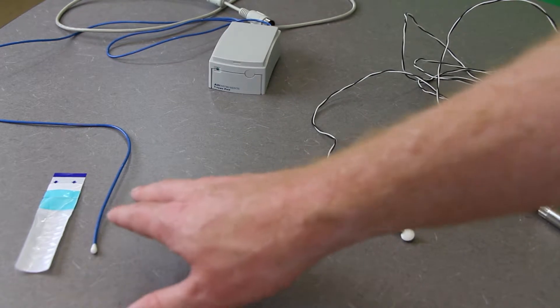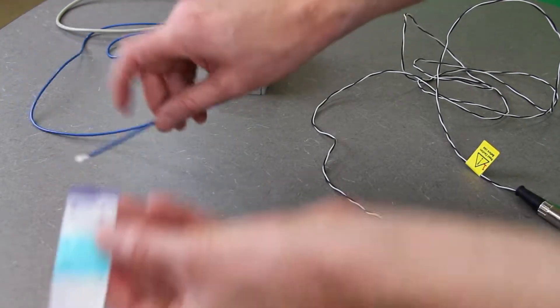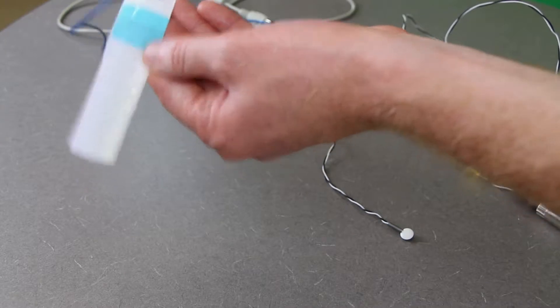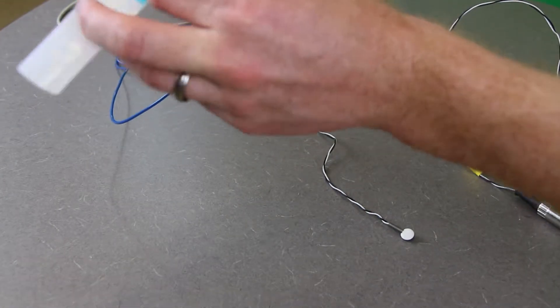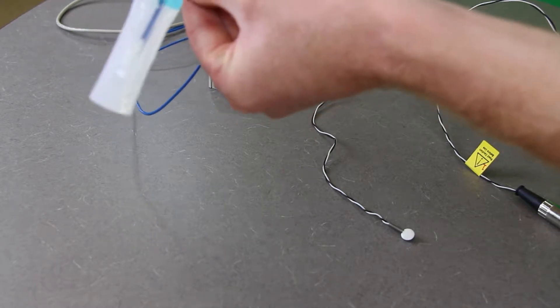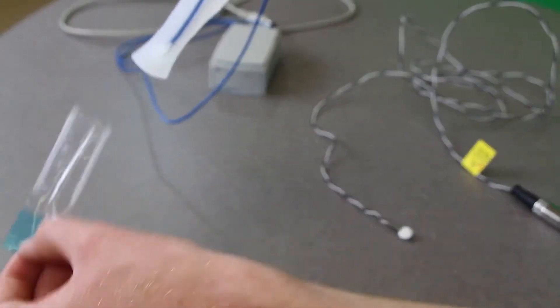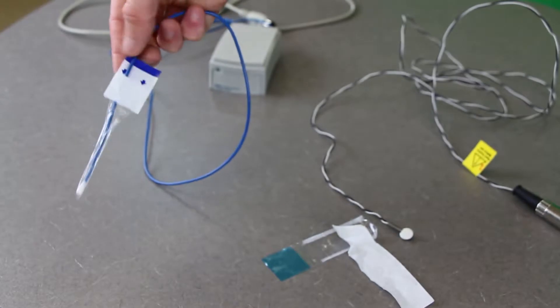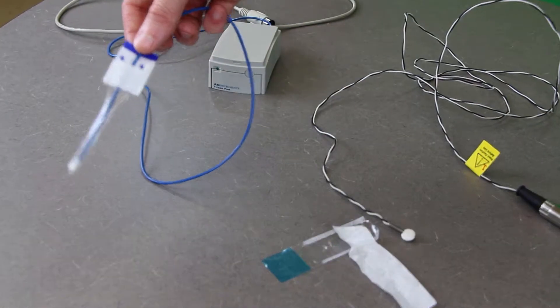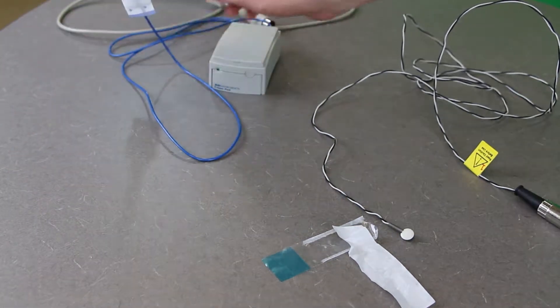When using the rectal temperature probe, you typically want to put it in a sanitary sheath to make it easy to clean up later. This is a little plastic sheet: where the arrows are, you peel up just a little bit, slide the probe in, and push it until it doesn't go any further. Then you peel the front off and peel the backing off as well — peel off the two sides — and this stays on while it's being used. When you're done, you simply take this off and clean it with a bleach-type solution or another strong cleaner.